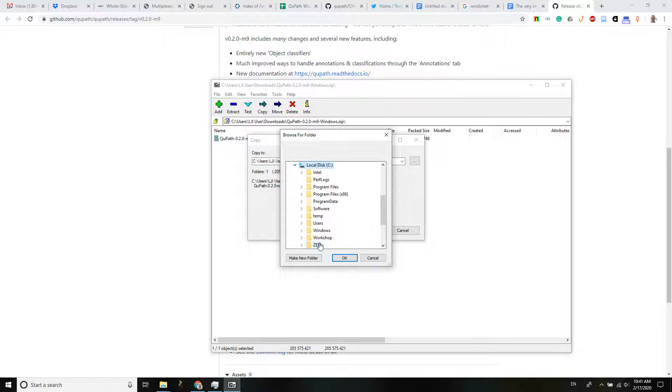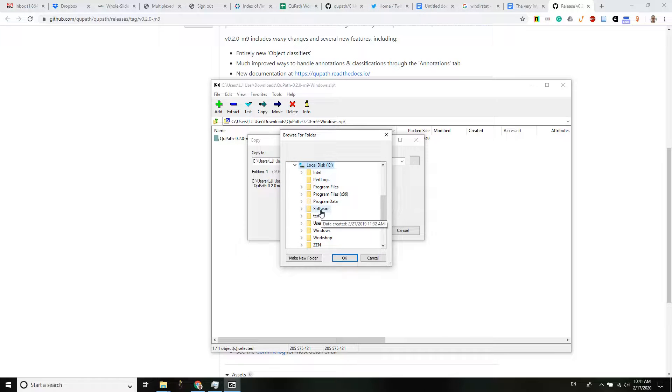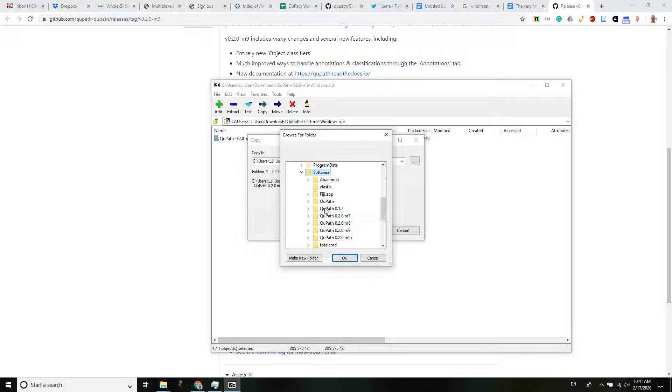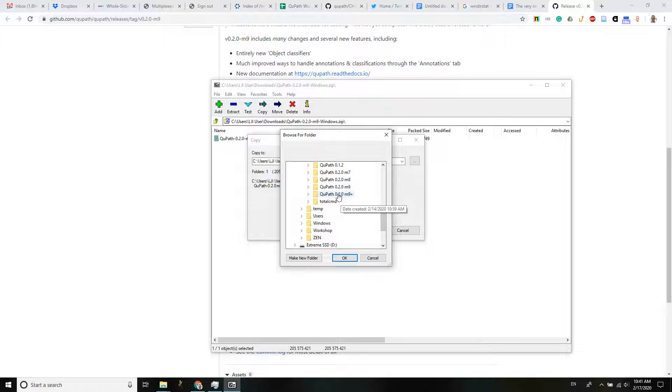So I've made myself a folder in my root drive, in my C drive, and it's called software. I have a couple of versions of QuPath and I'm just going to make a new folder.